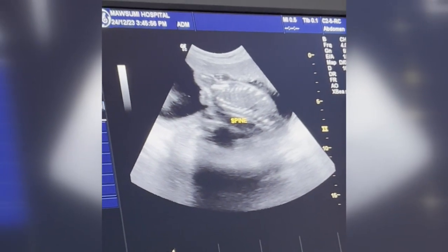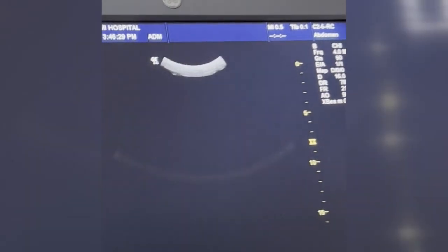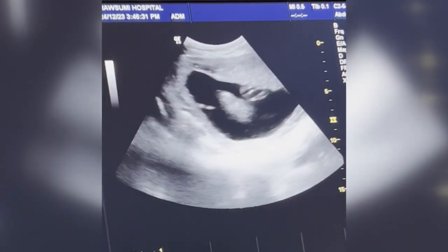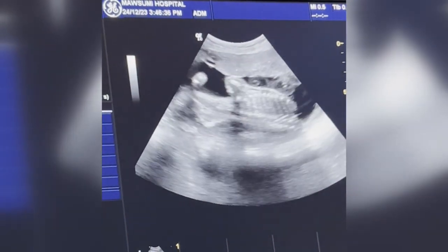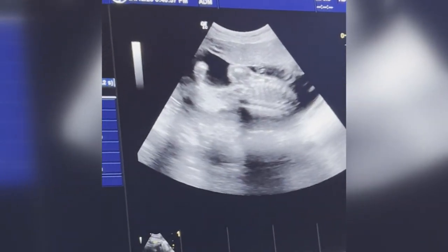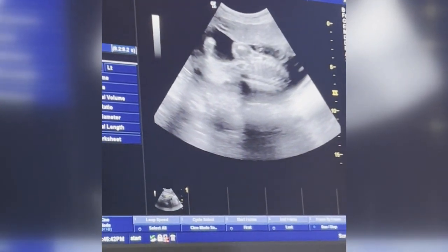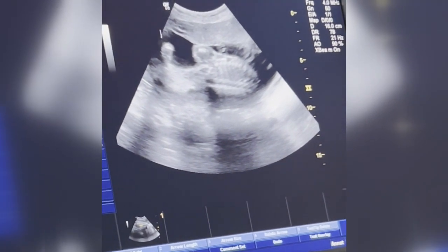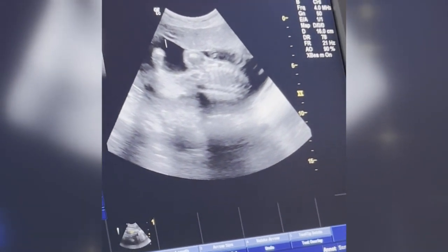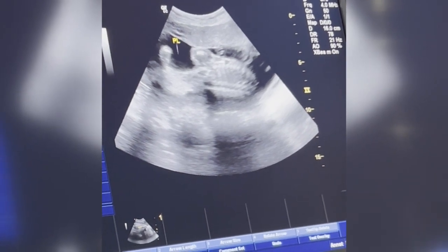Okay, now I shall see the placenta. Now, see the placenta? This is placenta. Placenta is normal, no problem. Placenta, lower portion.